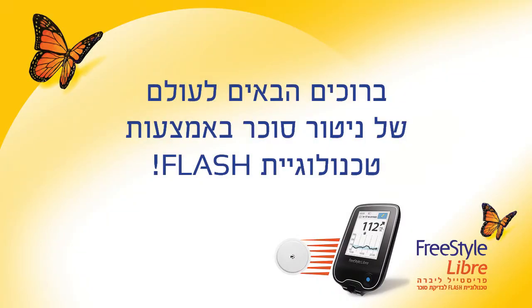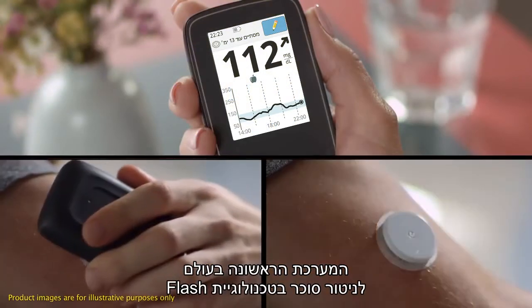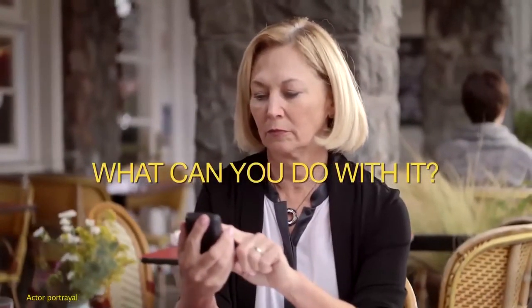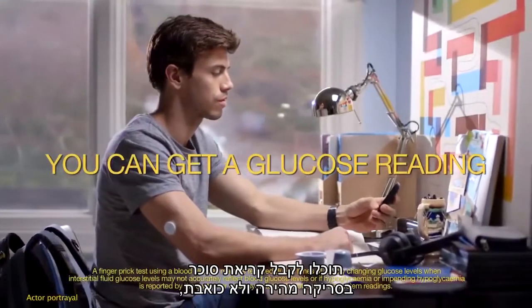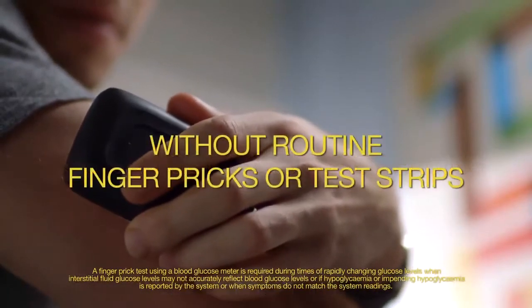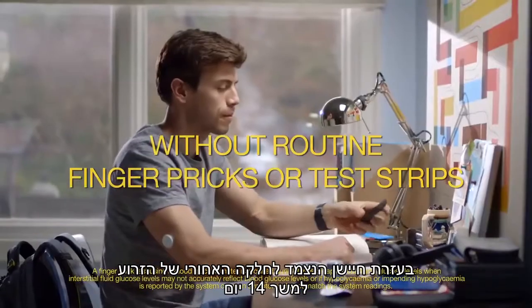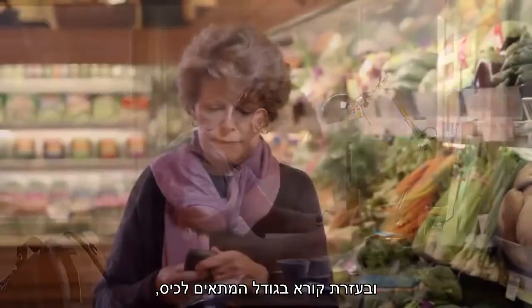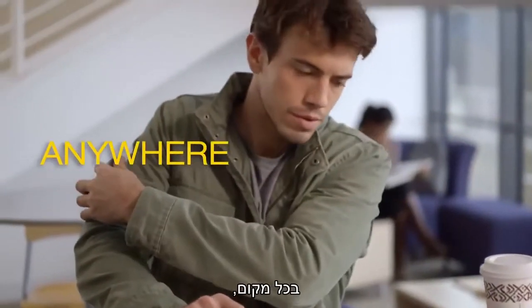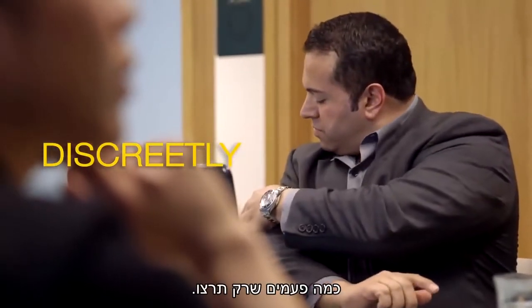Introducing the Freestyle Libre system, the world's first flash glucose monitoring system. You can get a glucose reading with a quick, painless scan without pricking your finger. With a 14-day sensor that you wear on the back of your upper arm and a pocket-sized reader, you can check your glucose anytime, anywhere, discreetly, as often as you like.